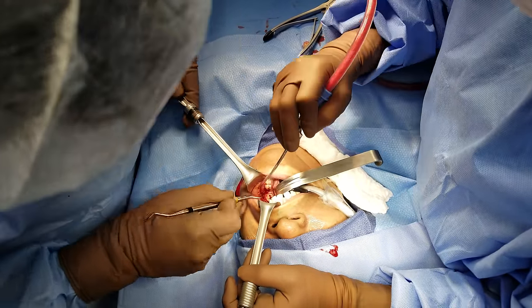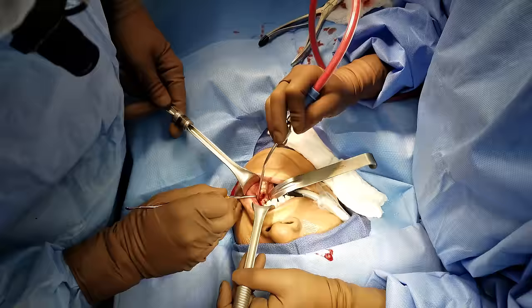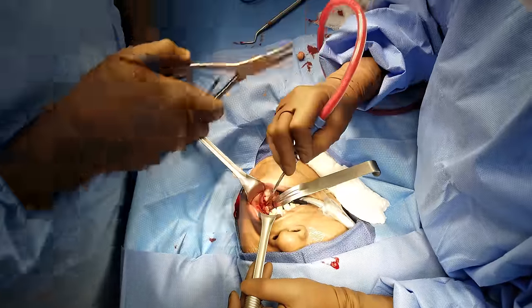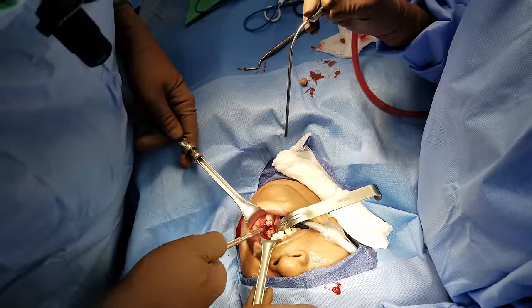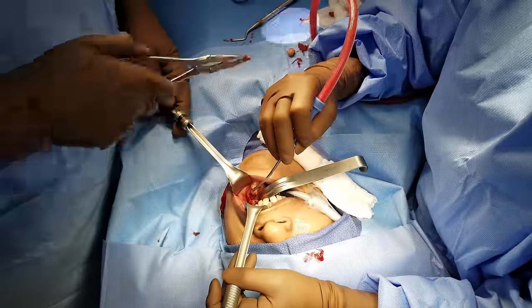Bruce, can I get a 4-0 chromic gut on an SH, please? 4-0 chromic gut on SH? Yep. Thank you.